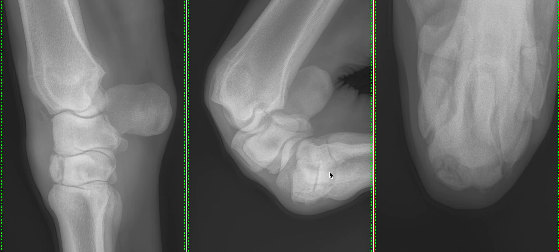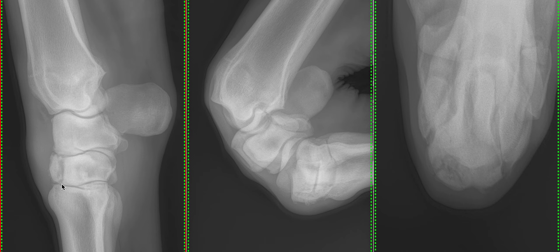I just wanted to start by looking at the obvious pathology. Looking at our soft tissues, we've got a dorsal swelling overlying the middle carpal joint. Remember our middle carpal joint and carpometacarpal joint communicate, but we have a moderate dorsal soft tissue swelling overlying the middle carpal joint. This is our third carpal bone, and we can see there's a radiolucent line extending through it from the middle carpal joint to the carpometacarpal joint.